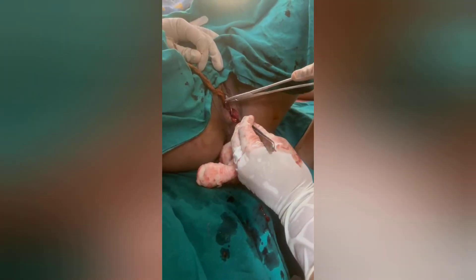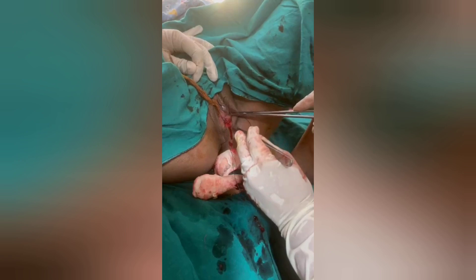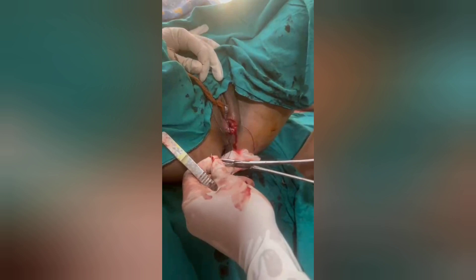This is the third layer — the superficial perineal muscles. So we finish with the vaginal epithelium, then with the deep perineal muscles, and now I am going with the superficial transverse perineal and bulbospongiosus muscle.